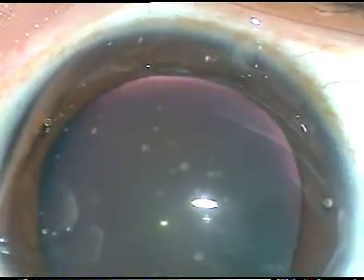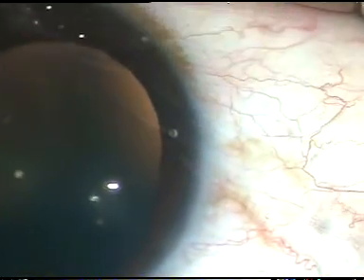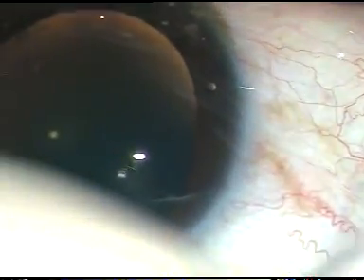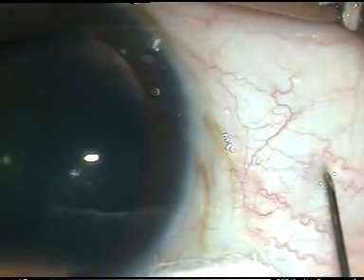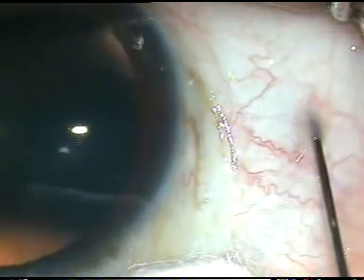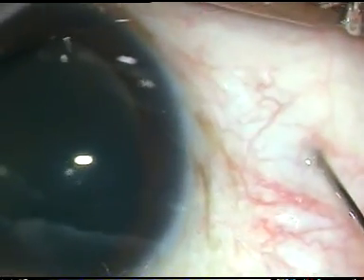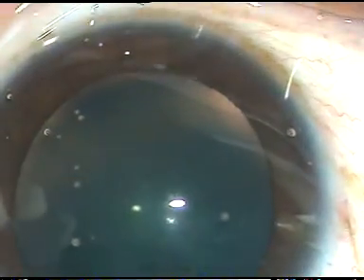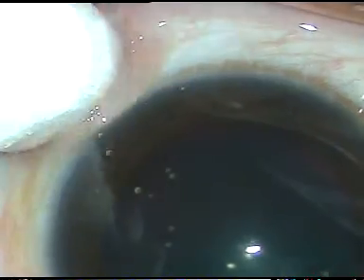Now, this is the marked point, which is about 3.5 mm away from the limbus. Before injecting, the conjunctiva is retracted like this — it goes almost tangentially for some distance obliquely and then turns inward. Just like a 23-gauge trocar is introduced into the vitreous cavity, in the same fashion the 30-gauge needle goes into the vitreous cavity.